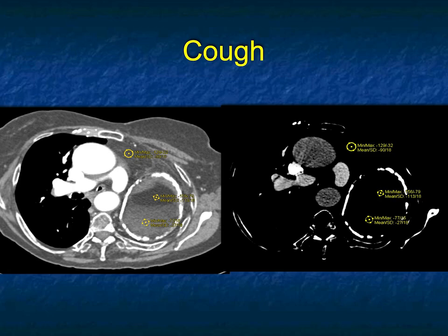What about this? Well, this patient had a cough and there's something in the left lung. If you look hard, right in the middle, it measures minus 113 Hounsfield units — that's fat. There's rim calcification and there's loss of volume in the left lung.